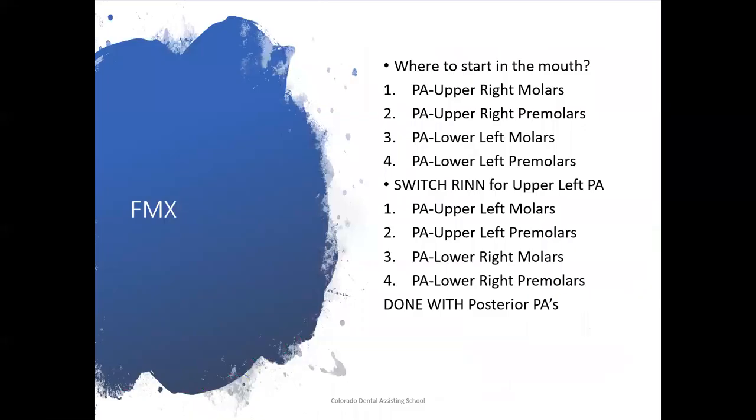This is showing you how to take the FMX if you were to write it out. This is more of a study guide. It's kind of hard to understand right now until you physically do this lab. So it's telling you where to start in the mouth. This might be something that you want to take a look at and kind of write notes on while you're watching either the video on our student portal or while you're in class doing it. But this is just reminding you where you're going to start.